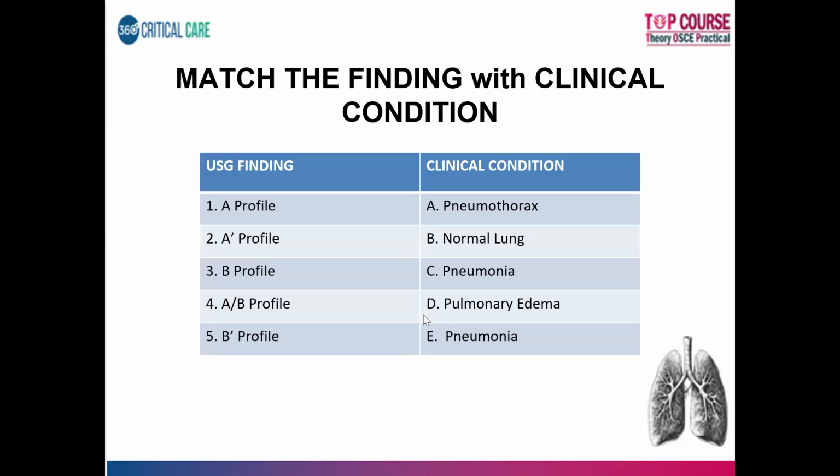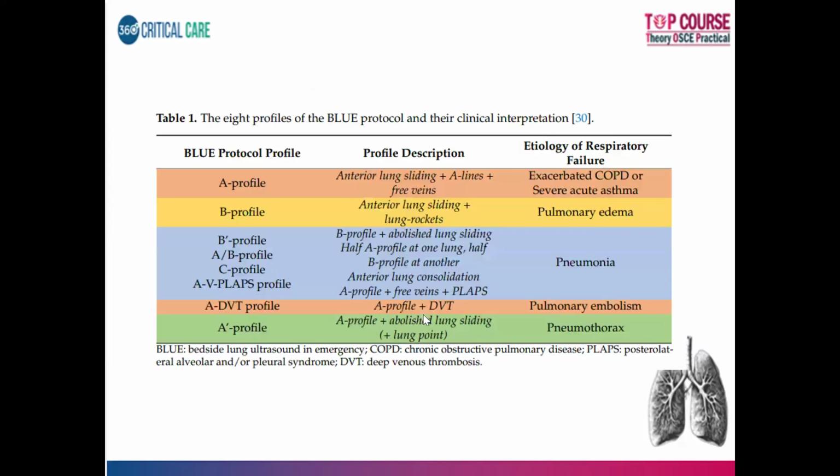Can anyone do the match the following? Are you guys willing to unmute and answer? If you unmute and answer, then I'll be able to go ahead with BLUE protocol and then go ahead with weaning. Otherwise it will be quite monotonous. Since you guys are not answering, I'll just directly go to the answer of BLUE protocol.